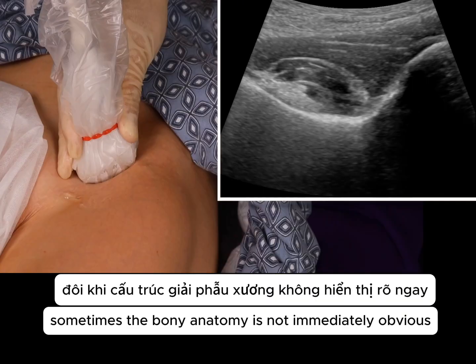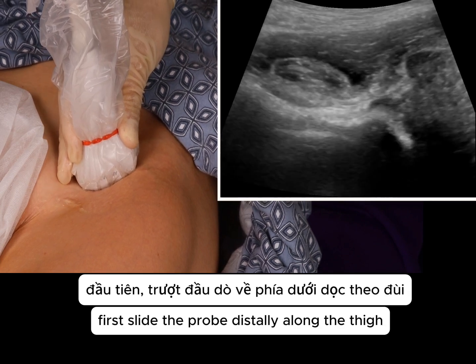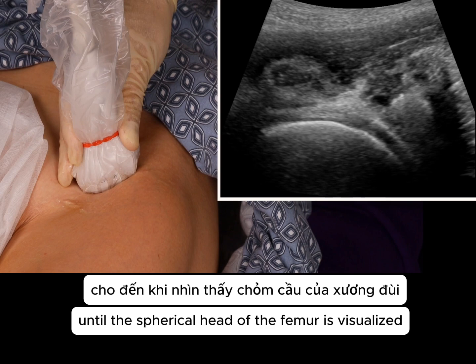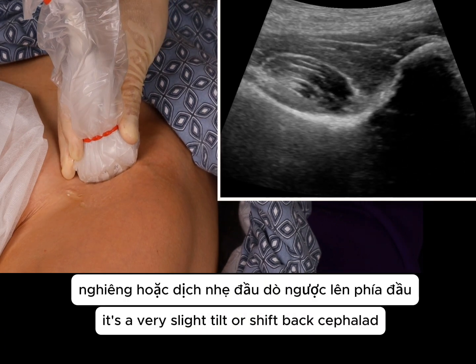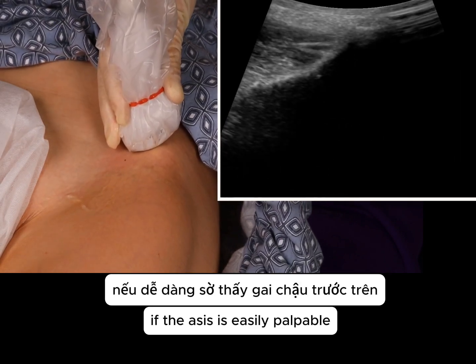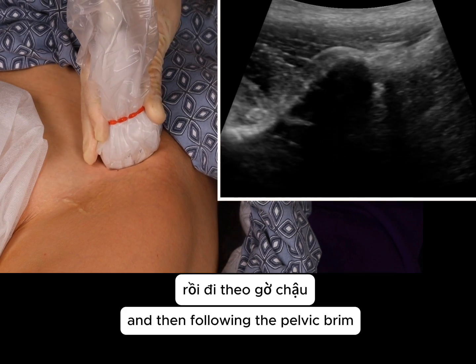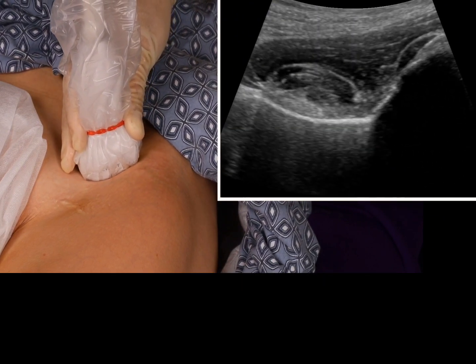Sometimes the bony anatomy is not immediately obvious, and there are two maneuvers to get to the right spot. First, slide the probe distally along the thigh until the spherical head of the femur is visualized. From there, it's a very slight tilt or shift back cephalad to get to the pubic ramus. Alternatively, if the ASIS is easily palpable, you can start by scanning for that bony landmark and then following the pelvic brim in an inferior medial direction.